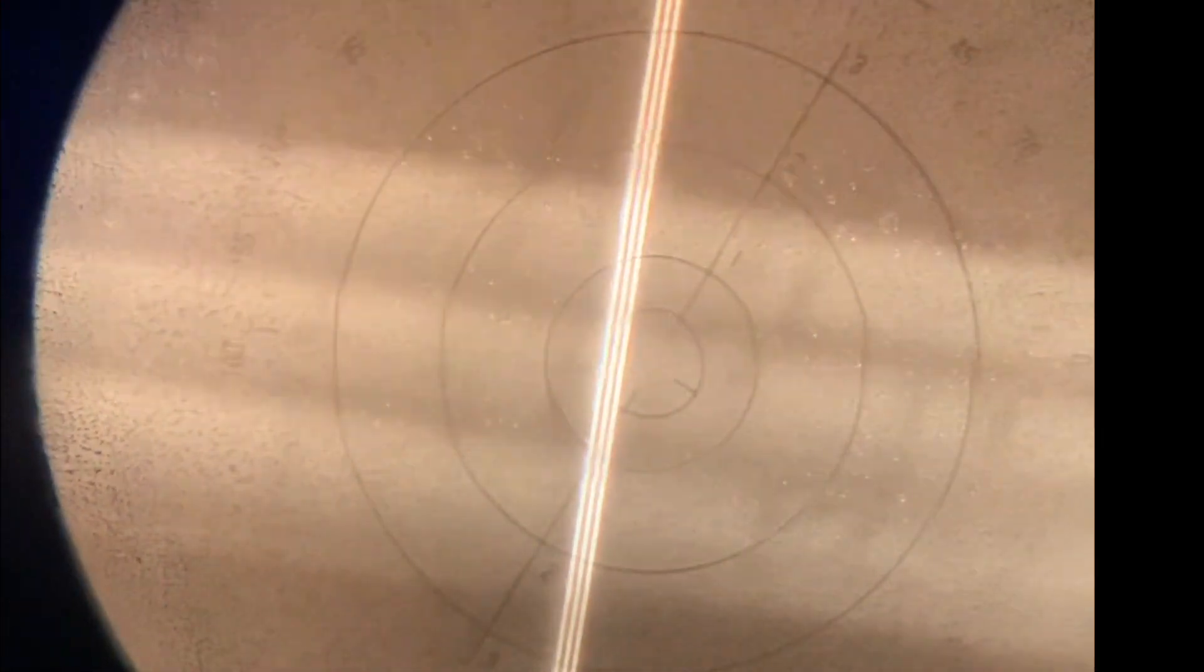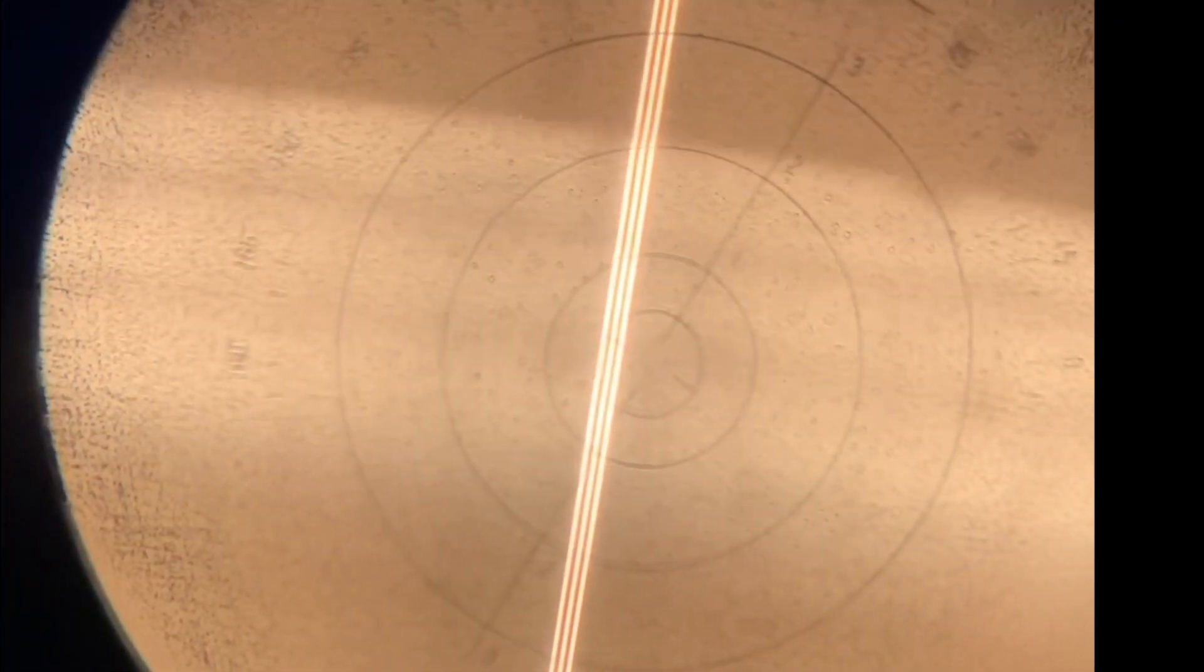Remember, in manual lensometry, we are finding the two principal meridians of a sphero cylinder lens. We can read a lens in either plus cylinder or minus cylinder.